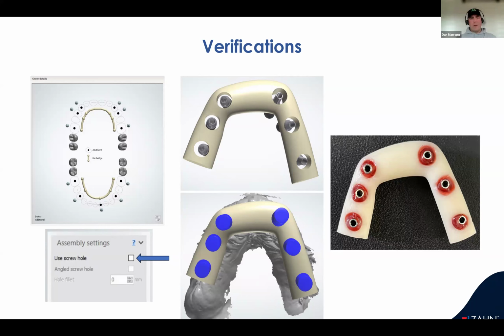All they had was a tissue scan with MUA heads on it. All you do is the same thing, and just run it through as a model instead of implant and cut a bunch of holes in a bar.